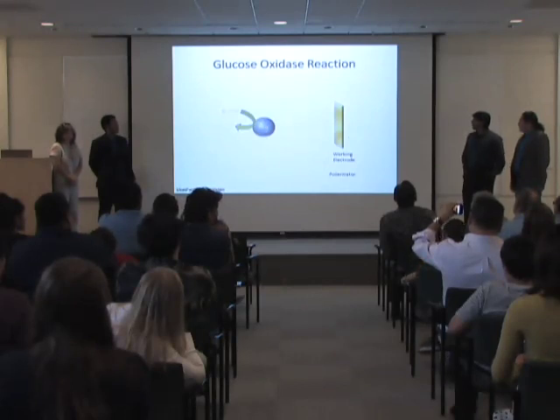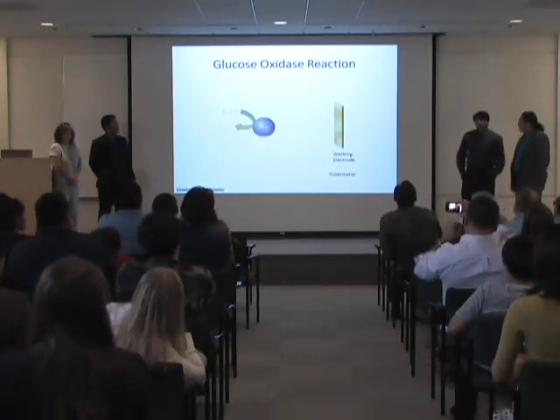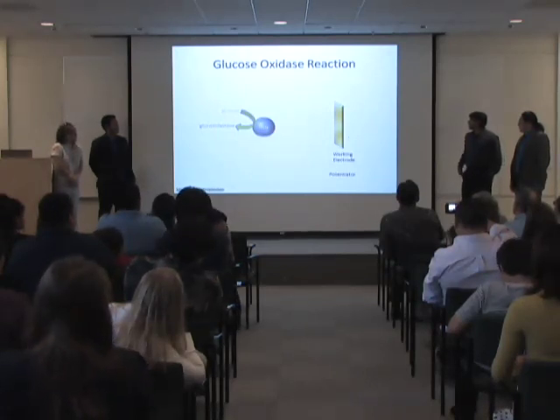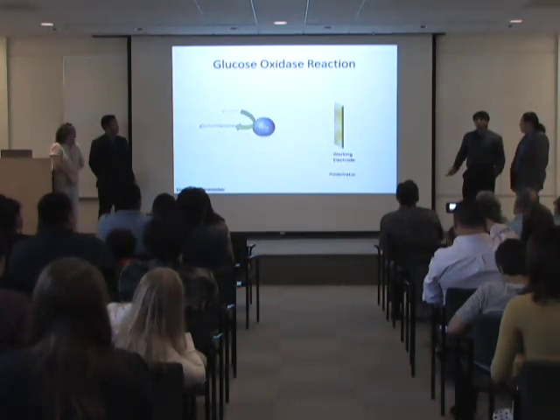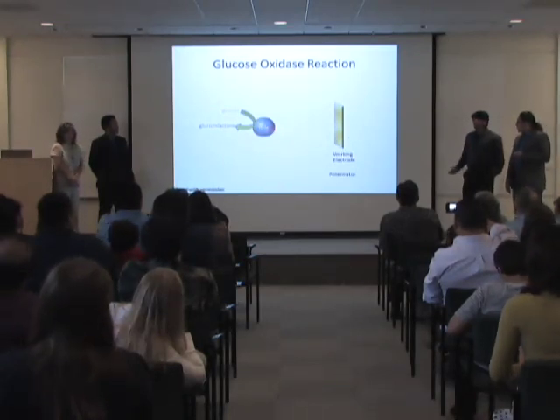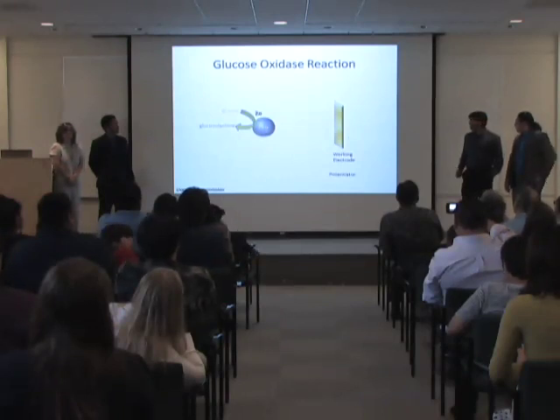Well, it's a simple chemical process. Now, we all have glucose in our blood. So when we draw blood onto a test strip, that glucose will react with a catalyst in the test strip called glucose oxidase. Now, glucose oxidase will oxidize the glucose right here, meaning that it will take away its two electrons. Once it does that, this catalyst is now reduced, meaning it is charged with two electrons.